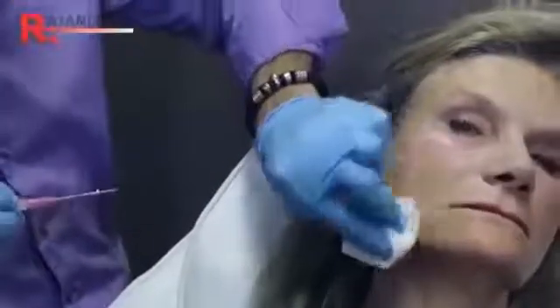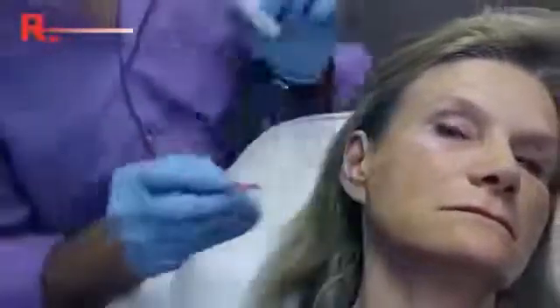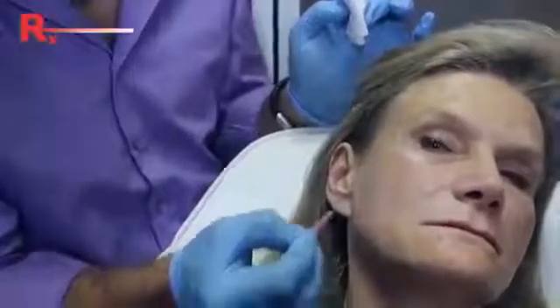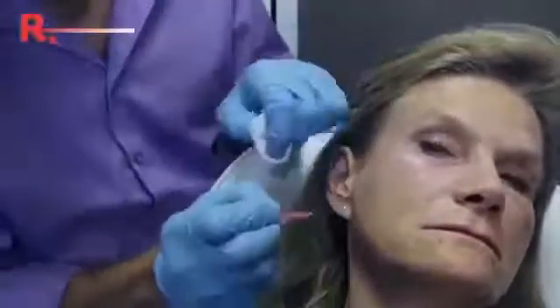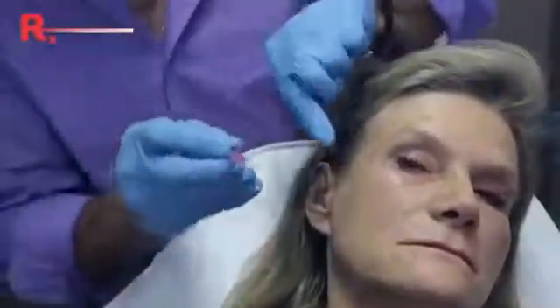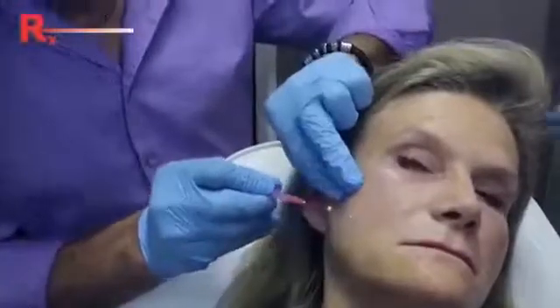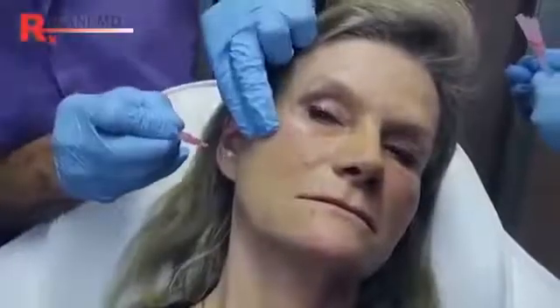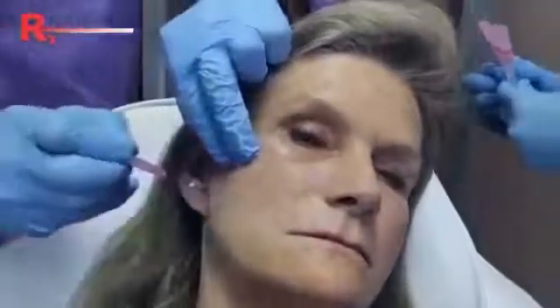Okay, so we're using our smooth threads here, and remember I said they're underutilized. Last visit we did some plasma sculpt through here, and now I can see where the lines are decreasing greatly, but I'm going to mix it up and do some threads since the plasma sculpt was about 6 to 7 weeks ago. So I line up where I'm going, bevel up, I want the bevel up with these, and I measure up to where I want to go.